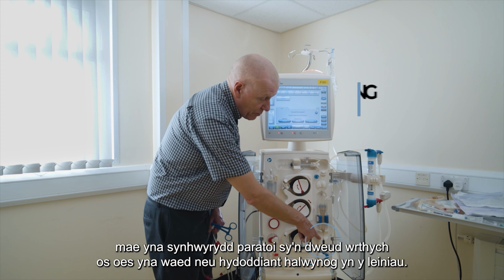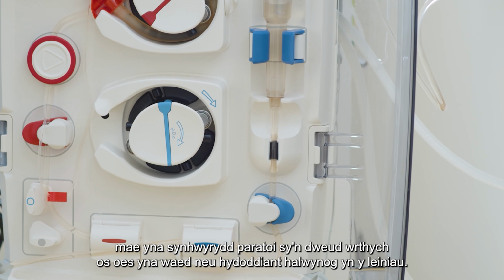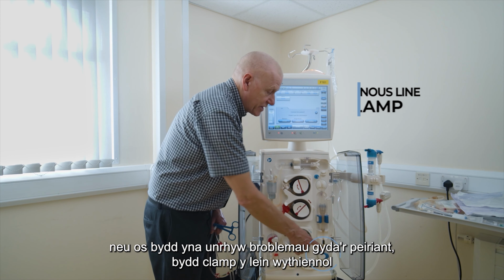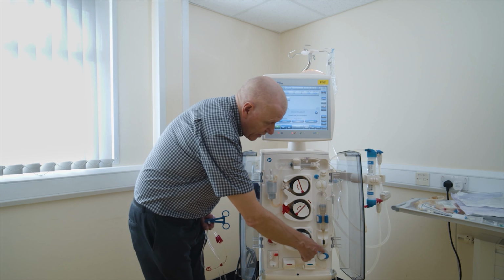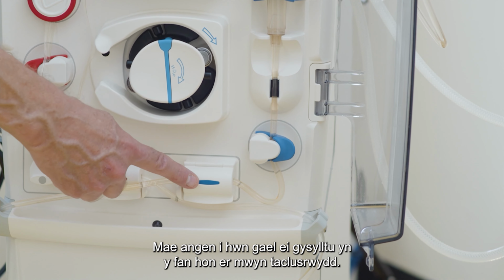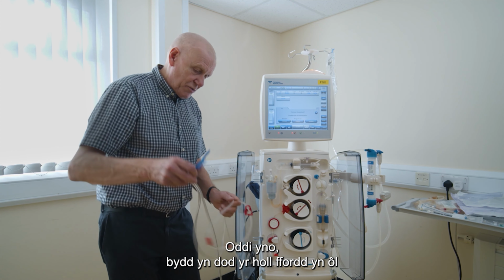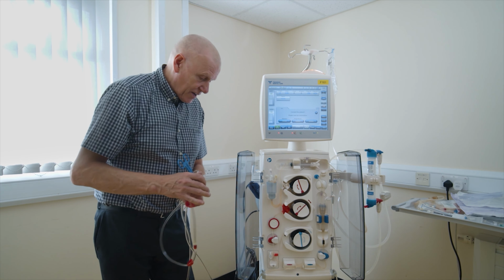Below the air detector, you have a priming detector. That tells you if there's blood or saline in the lines. And then just below that, you have the venous line clamp. If you should have air in there or any problems with the machine, the venous line clamp will close and stop the blood going back into the fistula. From there, the blood line comes back through the blood temperature module, the BTM, which needs to be connected in there just for tidiness. And from there, it'll come all the way back to your fistula. That's the blood circuit.